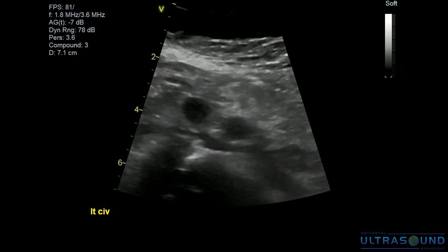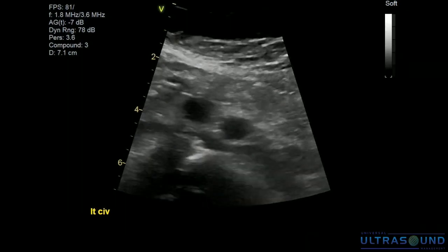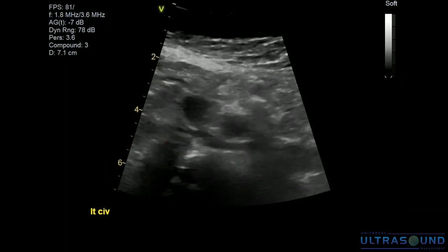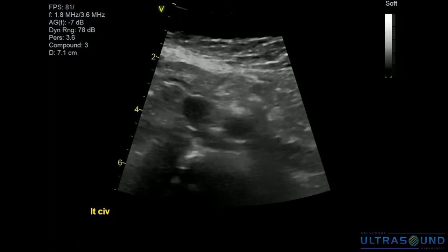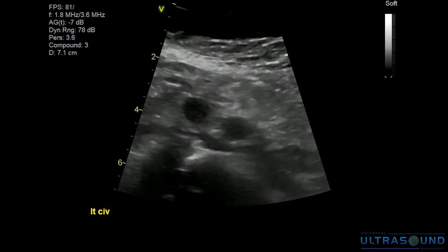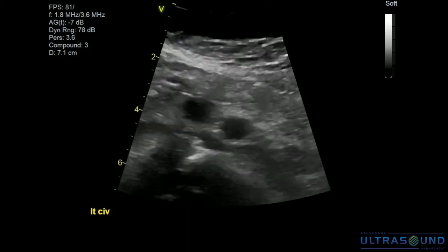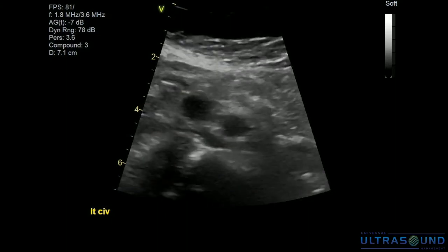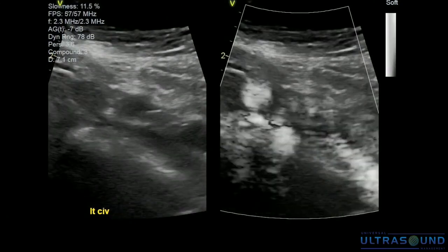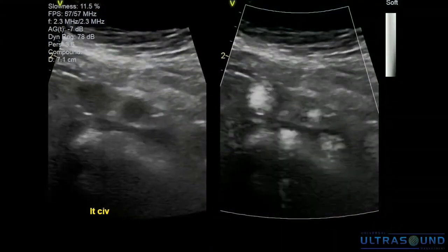So as we go up into the outflow veins, these outflow veins have poor ability to collateralize because these are wide vessels, a lot larger diameter than the lower extremity veins. Like I said, normal dimension of the common femoral is 12, then we go 14 for the external, 16 for the common, and then 18 for the IVC. So knowing now we have that mental chart in our head, looking at these veins, you can see right away that this isn't normal, right? And then knowing what we know as far as diagnostic criteria for what thrombus staging looks like, this definitely fits into the category of chronic old clot.